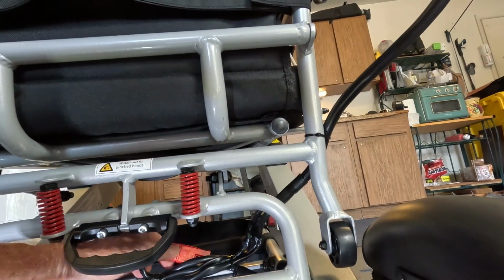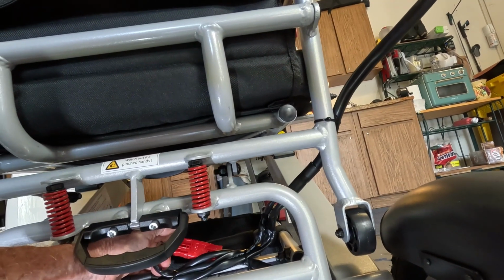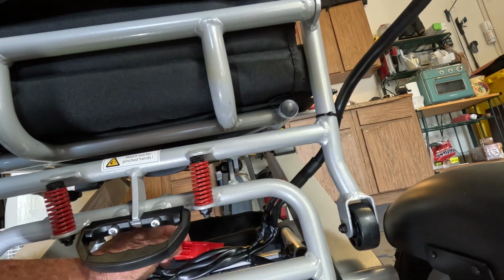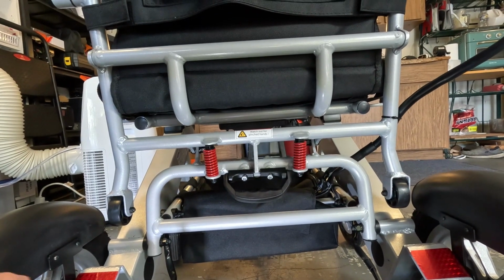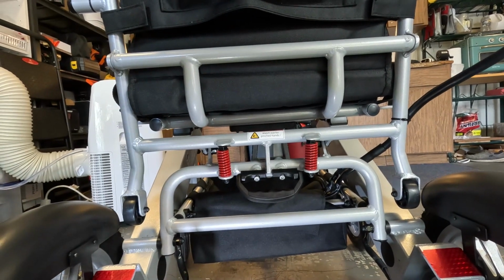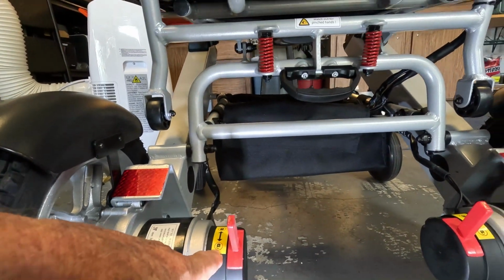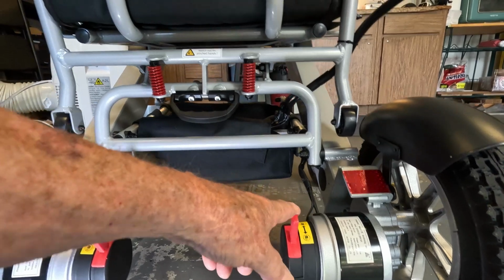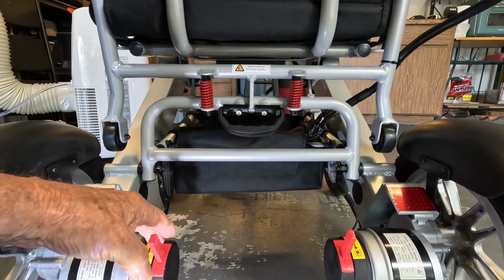Now, the first thing we want to do in the instructions is plug in this red connector. There'll be two halves there, and you just plug those two in if they're not already plugged in. While we're in this position viewing things, you notice these two levers right here. It's in the neutral position, or unlock. Right here is a little symbol. Now they both have to be in the same position always.